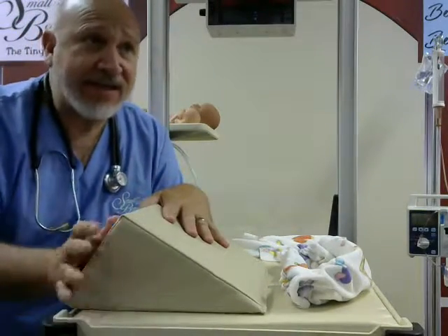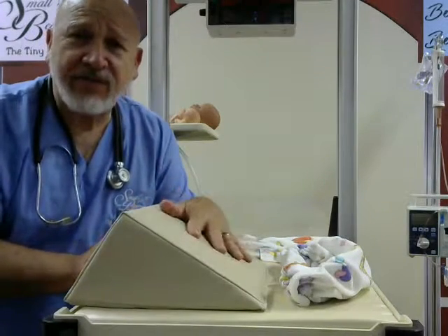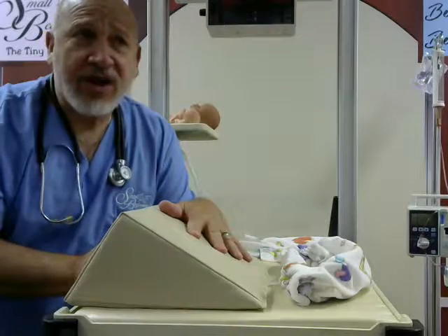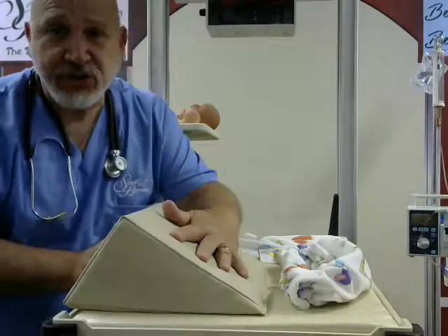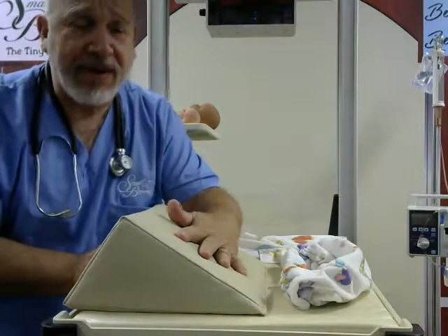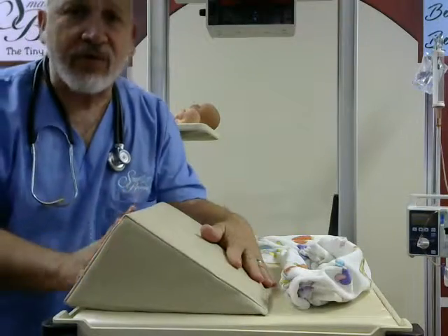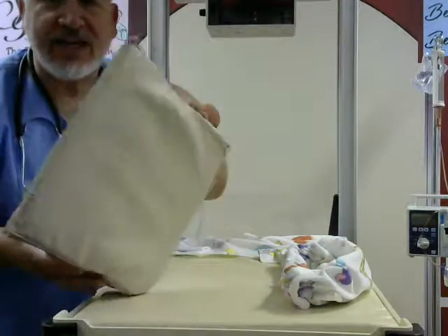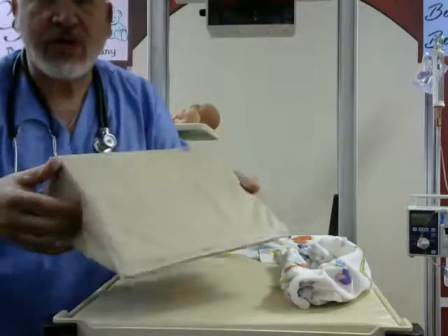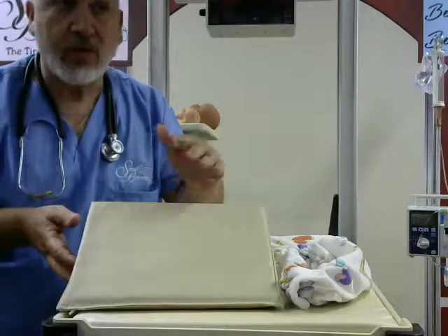This device is a simple helping hand for the nurse if she's trying to take care of a baby that has gastric reflux. It's a memory-foam wedge, which makes it very comfortable for the baby. And it's a wipe-clean vinyl that you can utilize over and over again in your unit. It's not too bulky — pretty small — and it fits in a bassinet, a warmer, or an isolette.